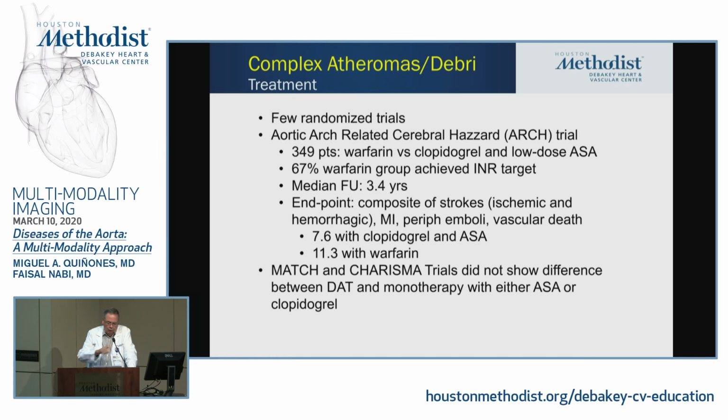And the question is, if you have one that looks as bad as the one I just showed you, in somebody that has had perhaps more than one recurring stroke, should one consider stenting it? Now that you can actually go in and maybe pluck that out? I would strongly consider it. I haven't had one yet, but I tell you something we should consider. If you have somebody with recurring strokes coming from an area that has a localized debris, should we just put a stent there and push that thing out? Or surgery, but stent is more appealing than having to go in and do an operation.